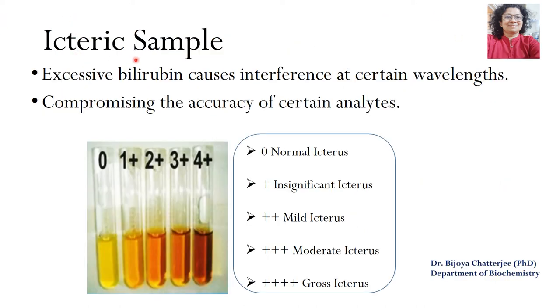The third factor is icterus. Icterus is caused by excessive bilirubin, which causes discoloration of the serum or plasma, and this excessive bilirubin will interfere at certain wavelengths, compromising the accuracy of certain analytes. The gradation of icterus depends on the increasing amount of bilirubin: 0 indicates normal bilirubin levels, 1 plus indicates insignificant icterus, 2 plus indicates mild icterus, and 3 and 4 plus indicate moderate and gross icterus.